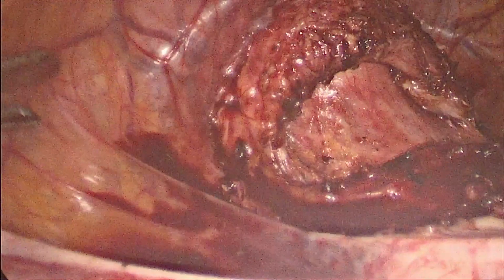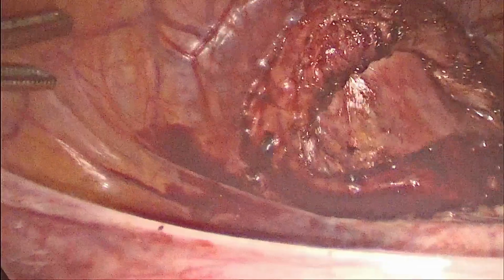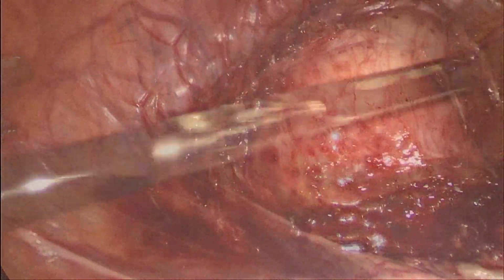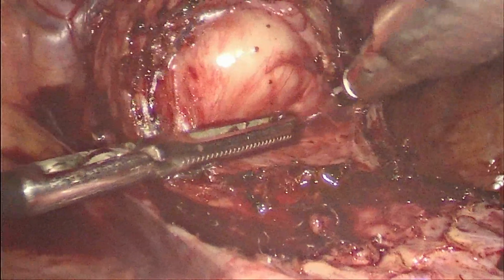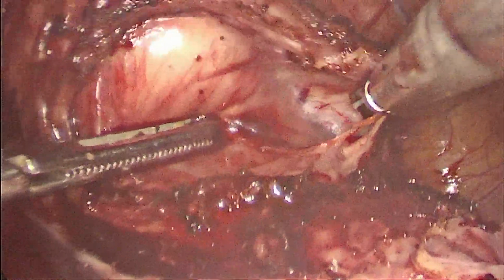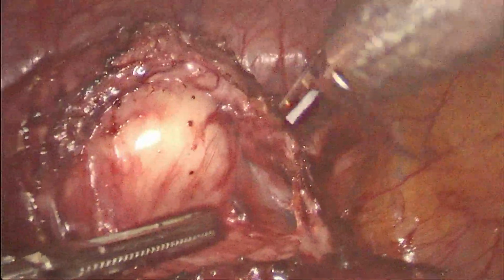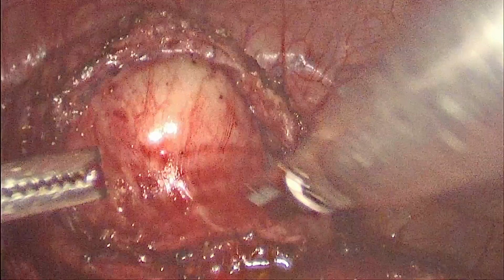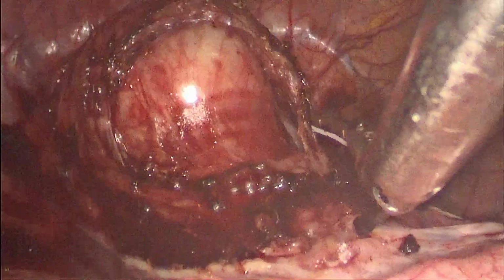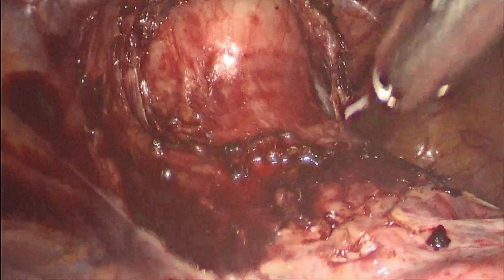So that is the cervix and anterior vaginal wall, which can be clearly seen. That's the cervix, which is very well separated, well away from the site of the scar area, sufficient enough to evacuate the contents of the scar pregnancy. And after identifying the scar area, we can excise very well.